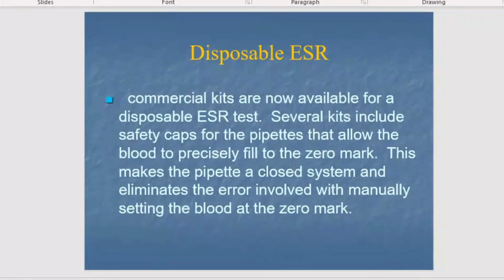You can also use a disposable ESR. There are commercial kits available for testing the ESR, so that's not an issue. Okay, so this is what I wanted to tell you about the erythrocyte sedimentation rate.